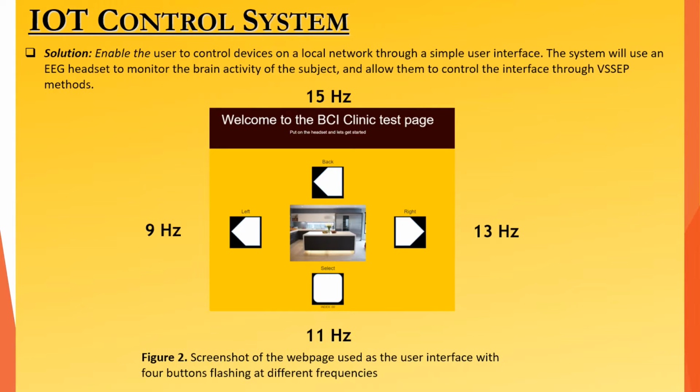Building on this principle, we created a web page with 4 flickering lights at different frequencies, the controls, that allow the user to maneuver through the icons representing rooms and devices within these rooms. The user is able to control these devices and toggle them on and off. Here's a video demonstration.